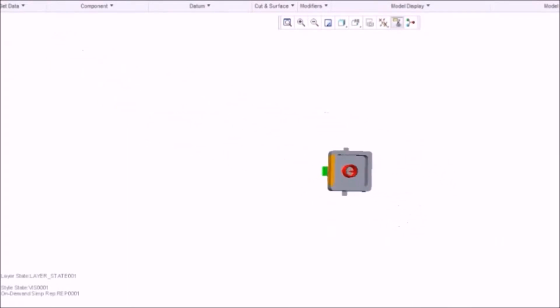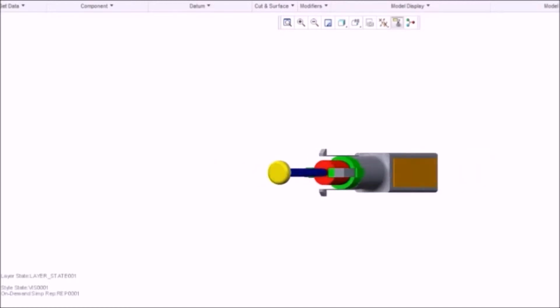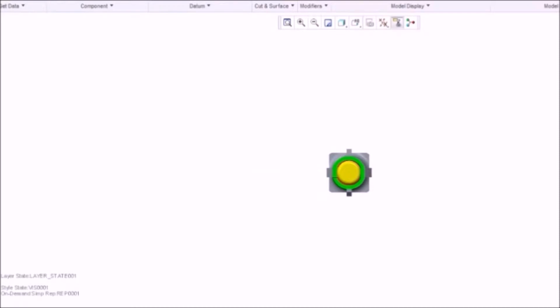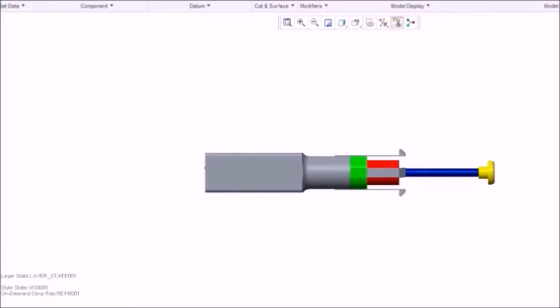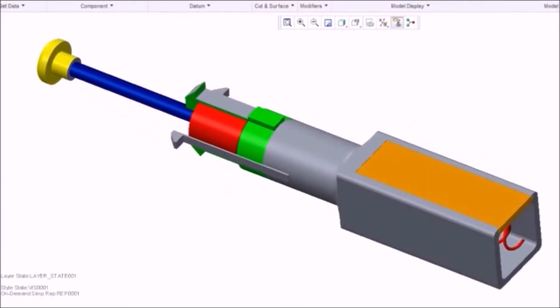The surgeon deploys the device down the working channel of an endoscope and onto a point bleed, isolating the blood from the bleed away from the cerebral spinal fluid by capturing it within the housing that surrounds the coil. The surgeon leaves the housing on the bleed for a few minutes to allow the film to bond before removing it, with an estimation being 2 minutes for the hemostasis to occur. The result is hemostasis with the device primed to stop the next bleed.